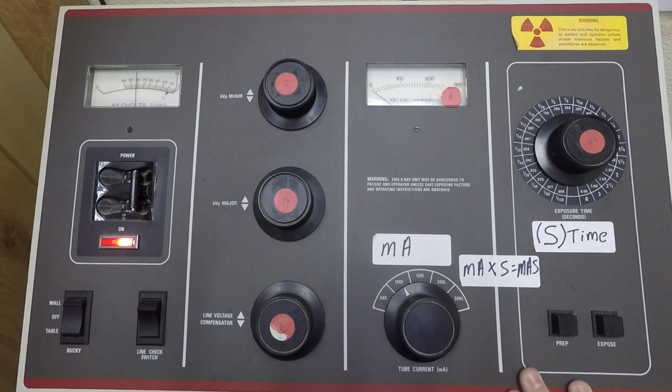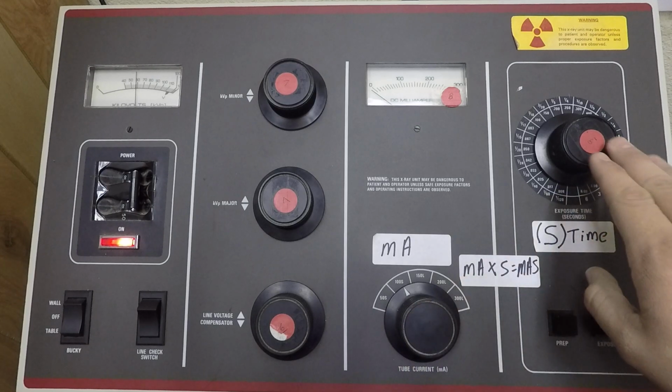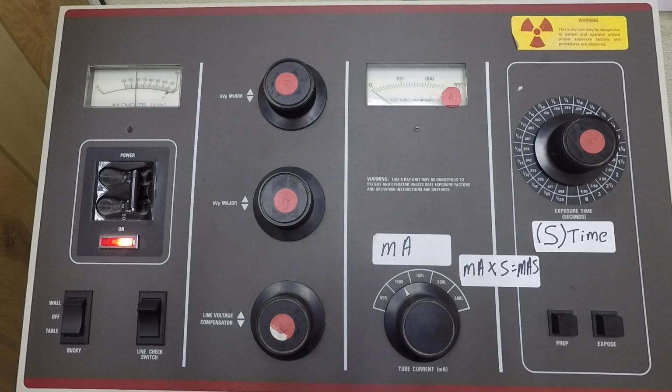I know as a student this always was one of the things that was very intimidating to me, was the use of the control console, because it seems like there's a lot going on here. But really, when you boil it down, there's just really two main things happening here on the control console. You're setting a strength for the X-ray beam and a quantity of X-rays to be created. So the quantity of X-rays being created comes from the milliamperage and time you make the exposure for.